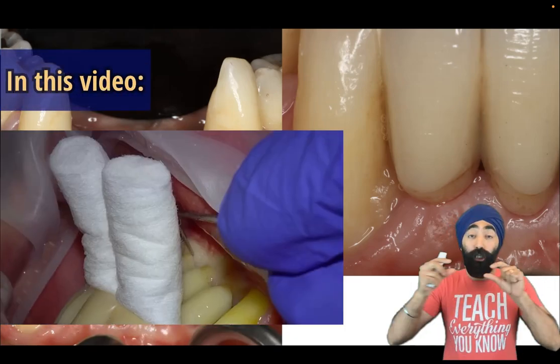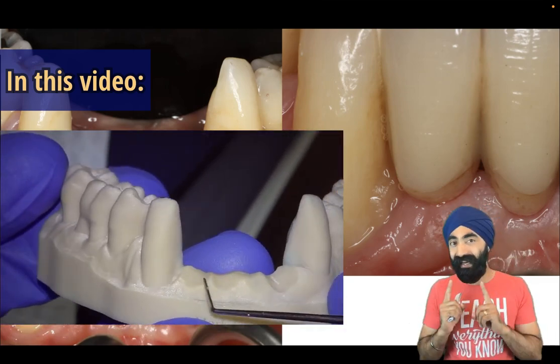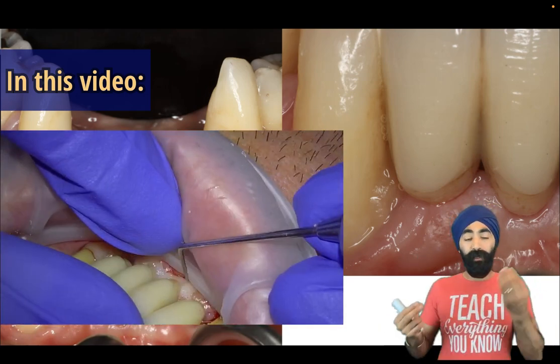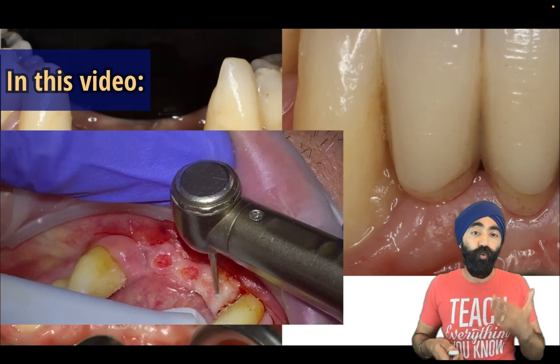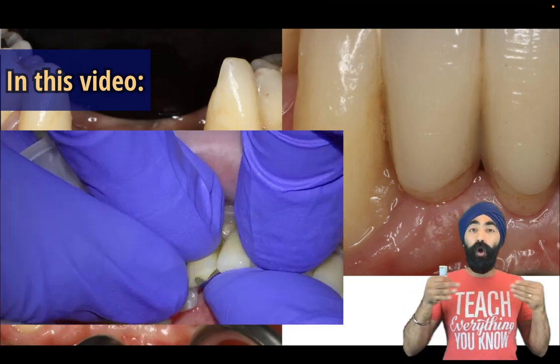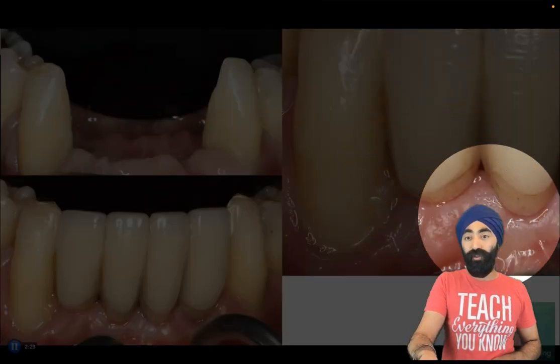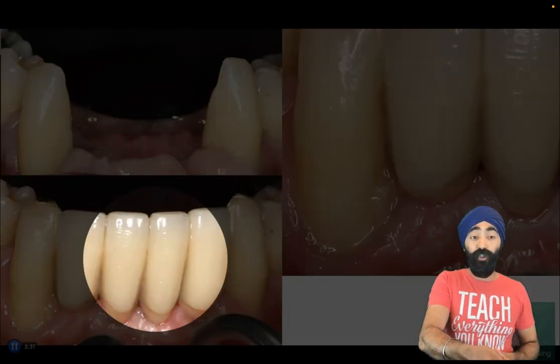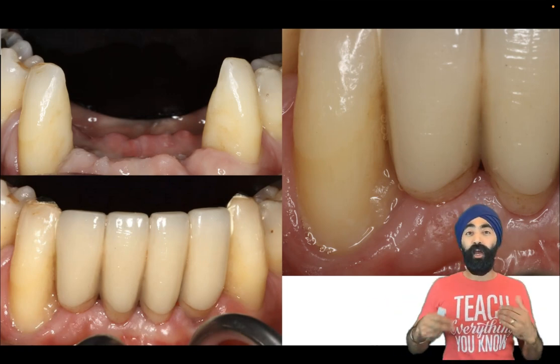In this video, I'm going to show you how I place a long span resin bonded bridge, replacing the lower incisors using the lower canines as abutments. The main takeaway from this lecture is how to manage the soft tissue. Because once the bridge came back, placing it on, I felt some resistance — the soft tissue was in the way. By managing it the way I did, the end result of having these ovate pontics as part of these resin bonded bridges is beautiful soft tissues that look like the tooth is emerging from the gum. There is a very limited amount of black triangles, yet we still get a cleansable space. So there are a lot of benefits here from having ovate pontics.